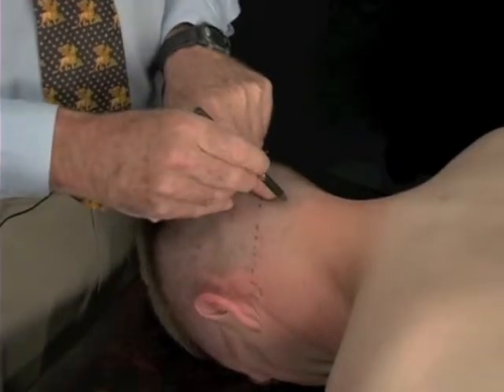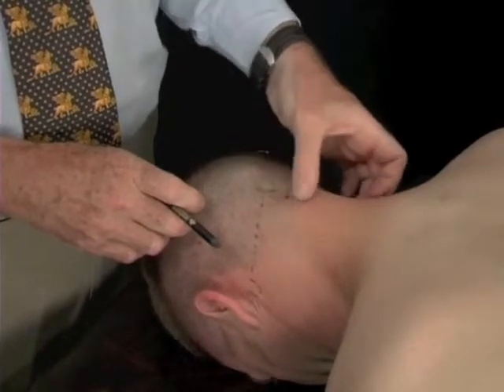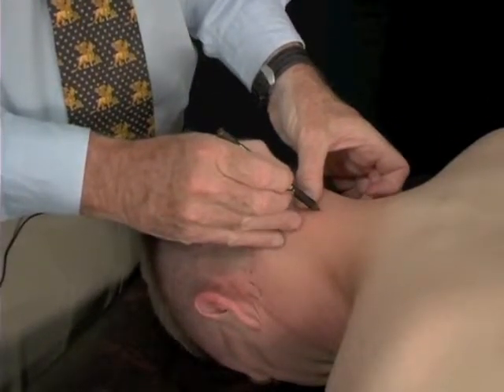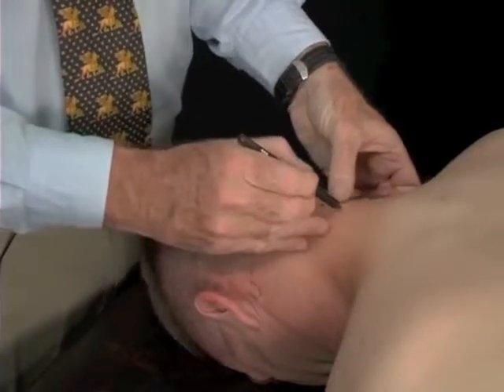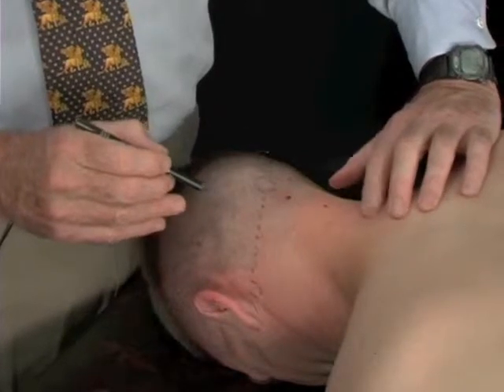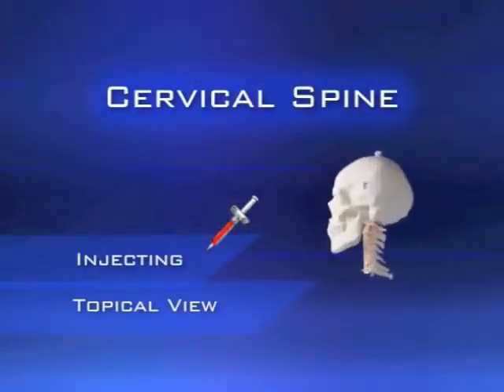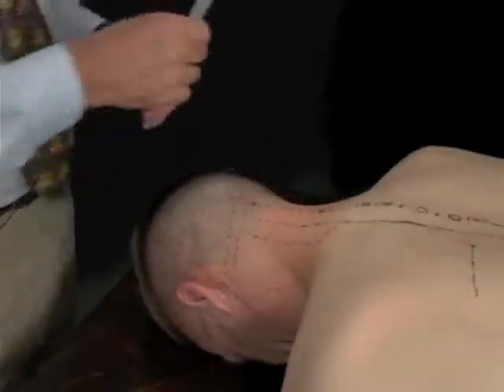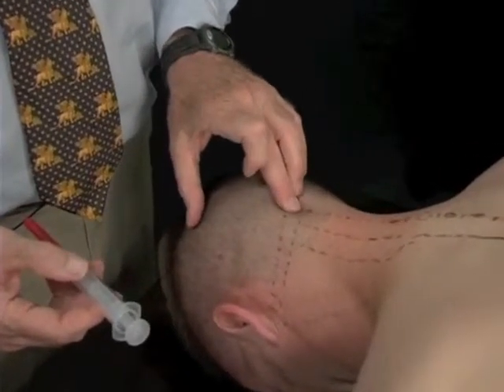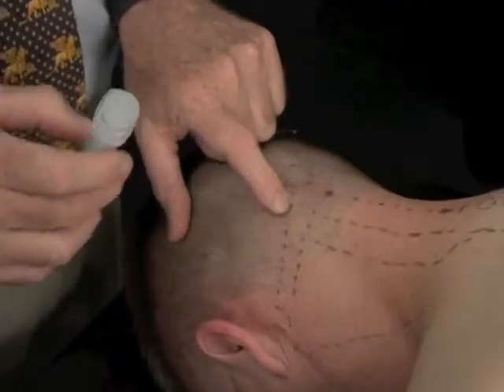It feels like C2 is right there, although on this patient I have some difficulty feeling it. Many times we can identify C2 and then have difficulty with the spinous processes below. I can prominently feel a spinous process here and on down, coming until I feel the prominent spinous process of C7. We then take our syringe with our chosen solution, keeping our finger below the inion in the no man's land in the middle.